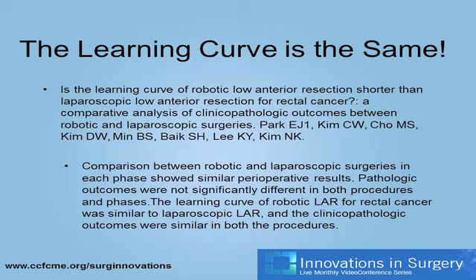You don't need to read the eye chart, but this sufficiently says that it's been done in rectal cancer. This is the purported benefit. I think if one was going to stipulate any potential advantage for robotics, it would be in the distal third rectal dissection. Now, the challenge with that is, this is much like the generals always fighting the last war over again.